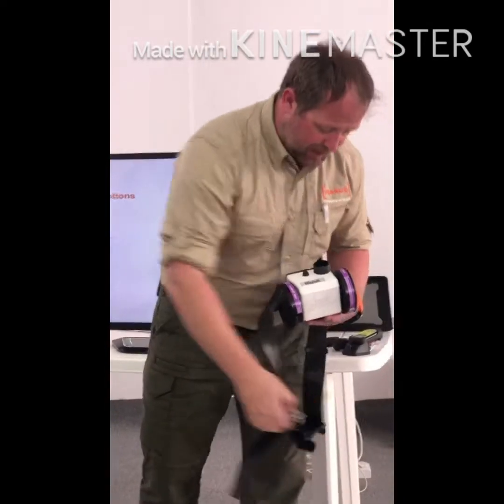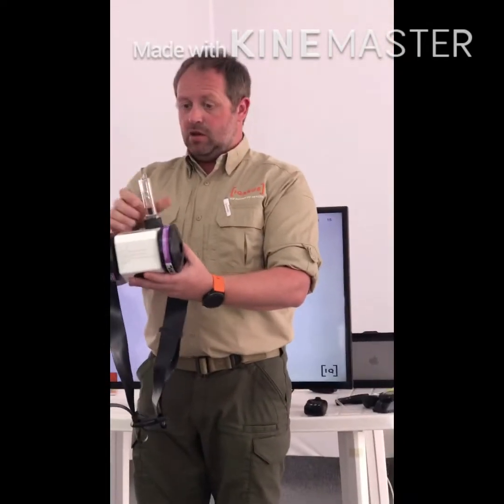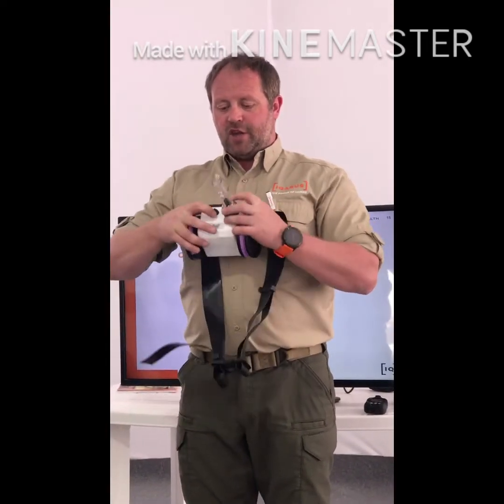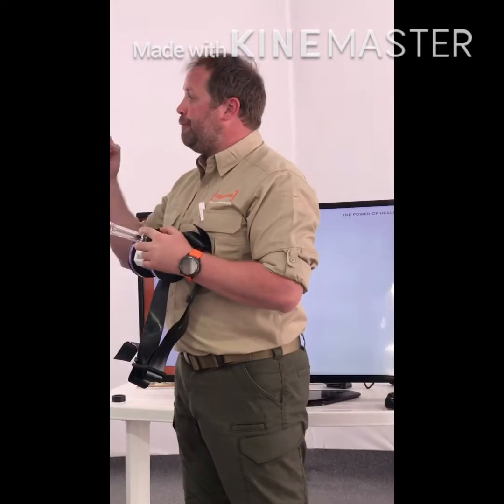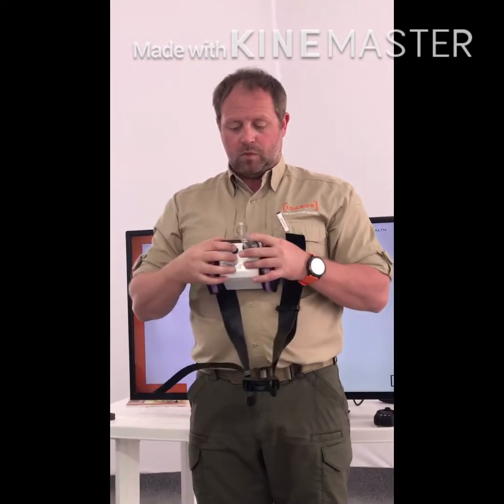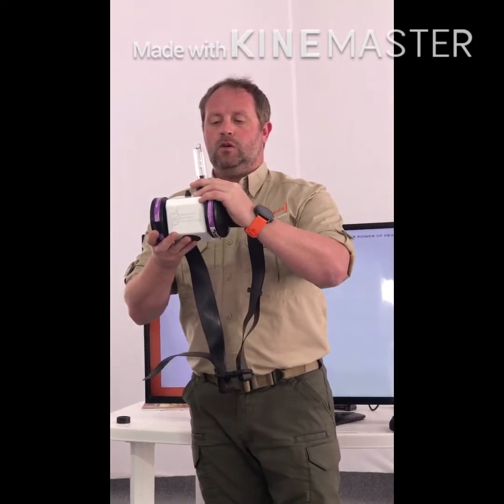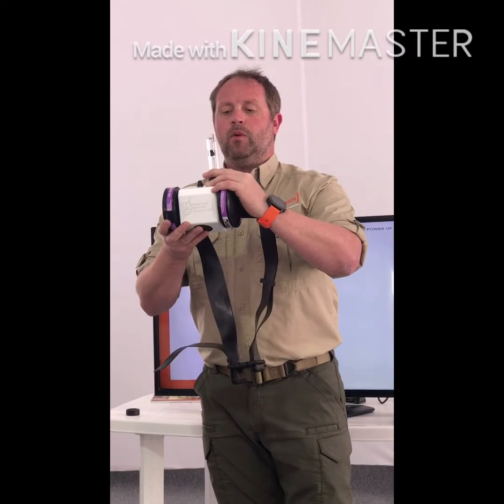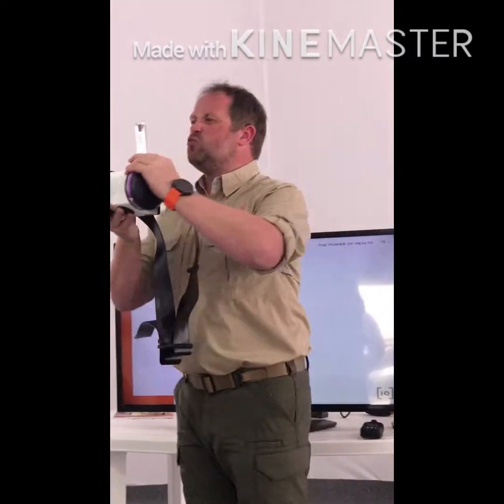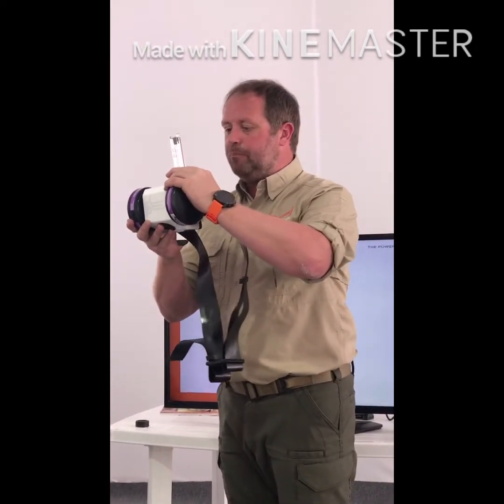Remove the top cap, place it in so you can see the lines. Okay? There's no point having it that way. Make sure you can see the lines. Then turn it on. What you'll get when you turn it on is you'll get 4 initial beeps. That tells me that it's working. Then the motor kicks in, and my little bung rises. Okay? This one's right at the top, so I'm quite happy with that. Okay? So I'd be happy to put that on.